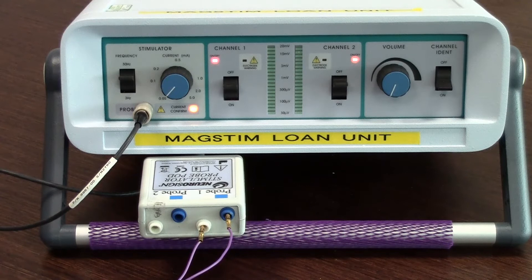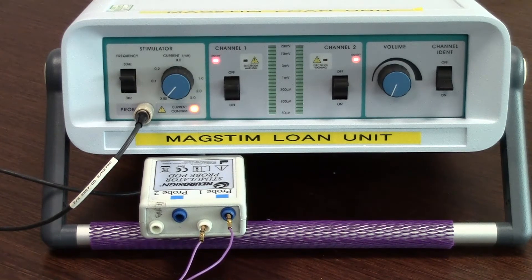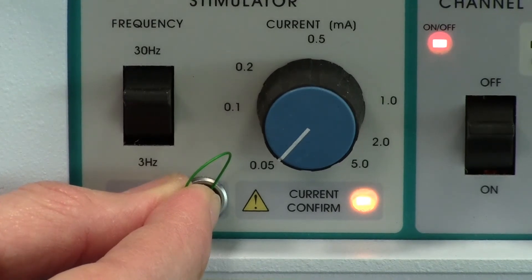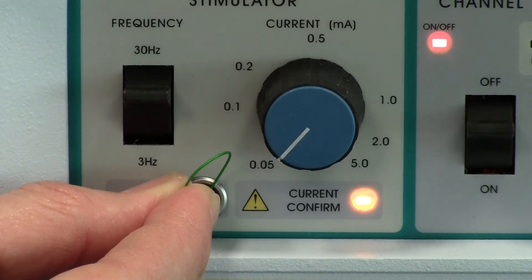Repeat this action on probe 2. If no light appears on the current confirm, this means there might be an issue with your stimulating pod. To ensure that the monitor is not at fault, please put a link wire between pins top right and bottom right.